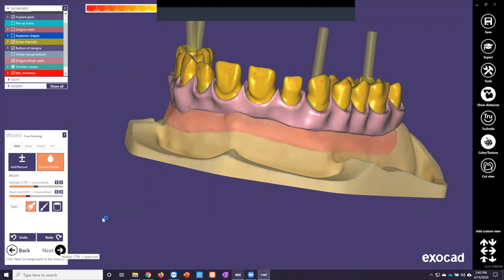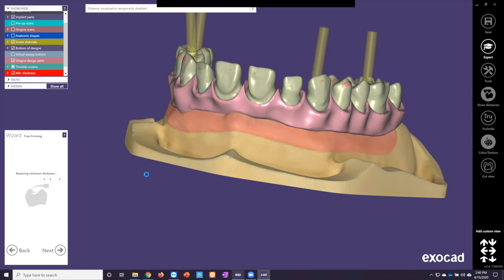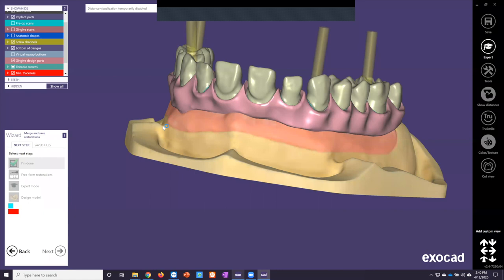A question here, Lucas: does this version of exocad play nice with AMD hardware? Yep, AMD compatibility is built into the Plovdiv release. As some of you might remember, in Matera there was a separate release for the Ryzen processors, but that fix is built into Plovdiv. Beautiful, thank you.